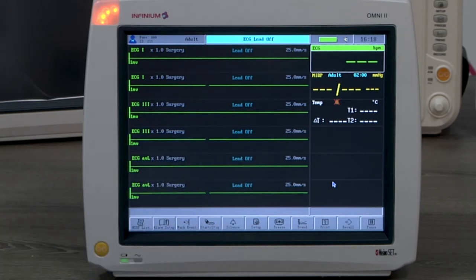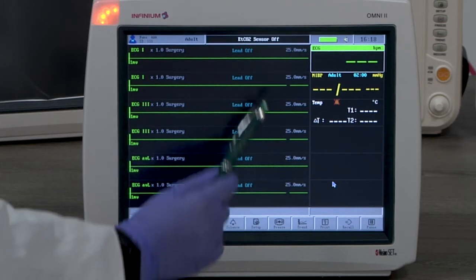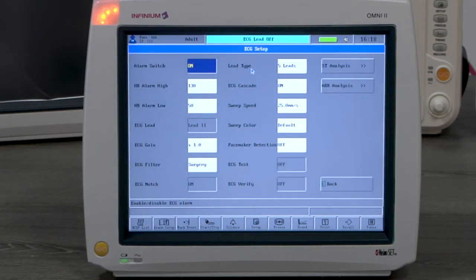The ECG cascade option, when turned on, allows you to select the same lead to be displayed on the next waveform channel.